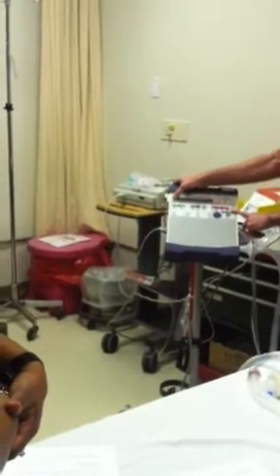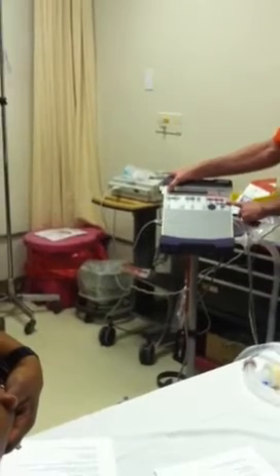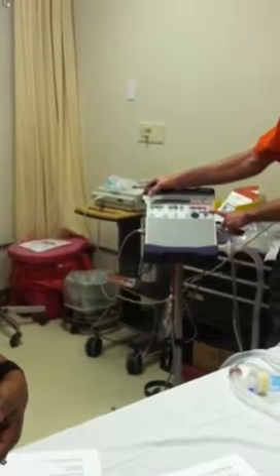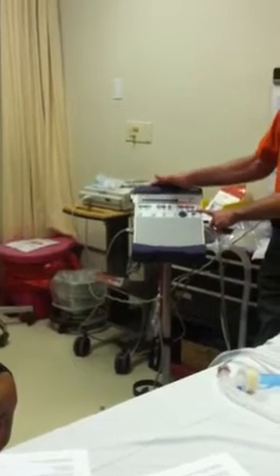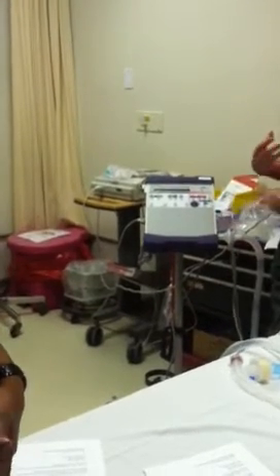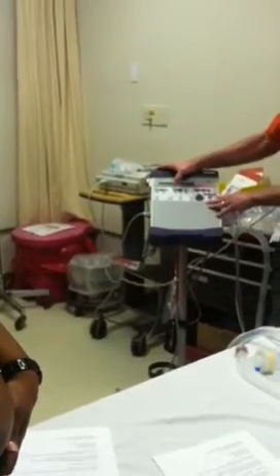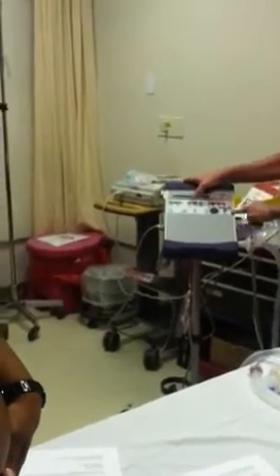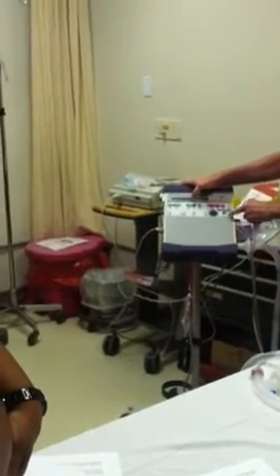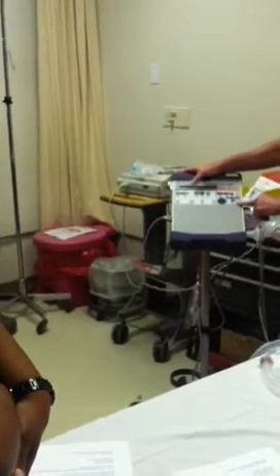Now when you're in this control mode over here, assist control, we don't have pressure support. Pressure support is a mode that helps the patient breathe. It gives them support. The lungs are expanded, so when they go to take a breath, they can breathe just a little bit better. You've got pressure support, and you've got PEEP over here. Pressure support is for ventilation, whereas your PEEP is going to be for oxygenation. So that's the difference in the two modes.